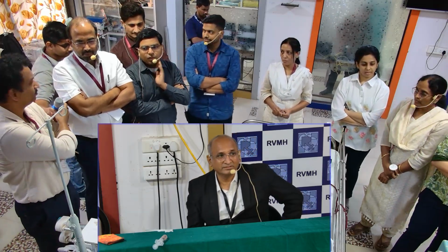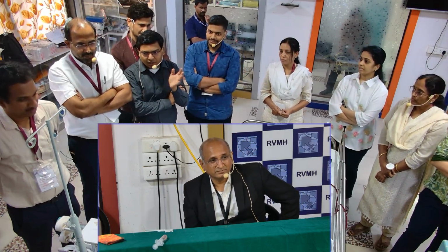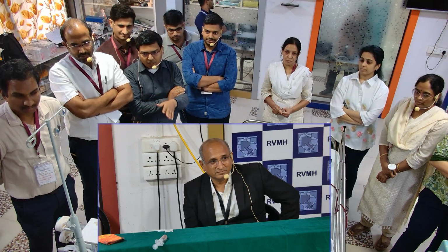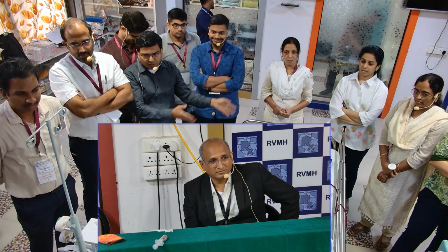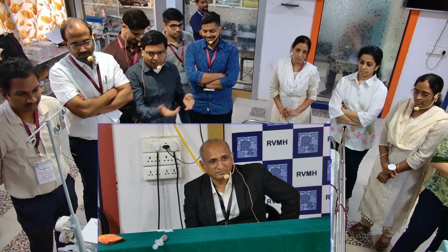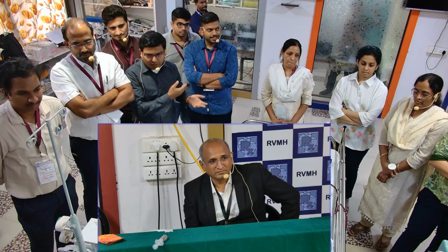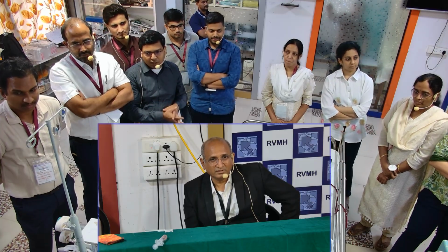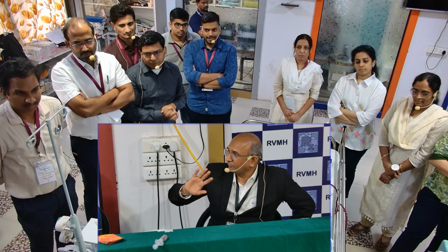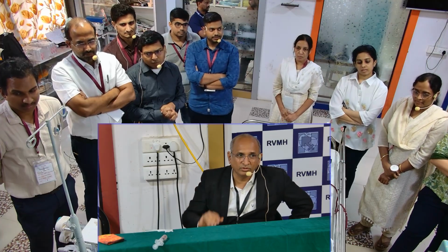Okay, fine. Handover has to be thorough, sir, so that we know when the HME filters have been changed, and when during the giving care for the patient also, whether something has happened. If the handover is thorough, then we can anticipate things more. Okay, but it's not that the filter has to be changed regularly. We don't usually do that.